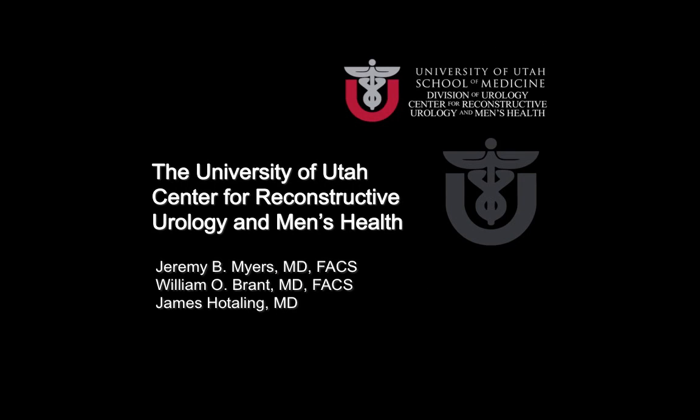As you can see, the harvest of the gracilis muscle flap is very simple after having some short experience with the procedure. It's reliable, the vascular pedicles are usually very consistent, and it can aid in the success of perineal operations, especially after radiotherapy or with very complex groin and genitourinary infections. This has been a presentation from the University of Utah, Center for Reconstructive Urology and Men's Health, and I hope that it helps. Thanks.